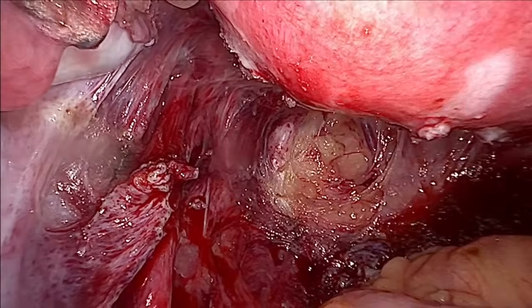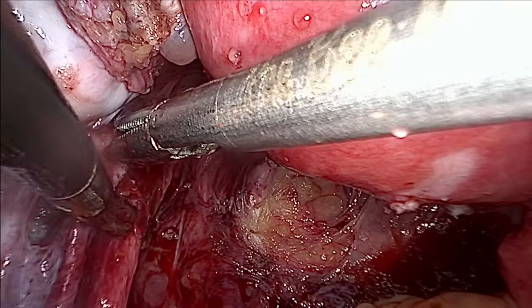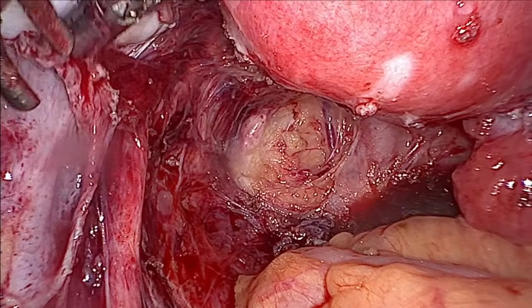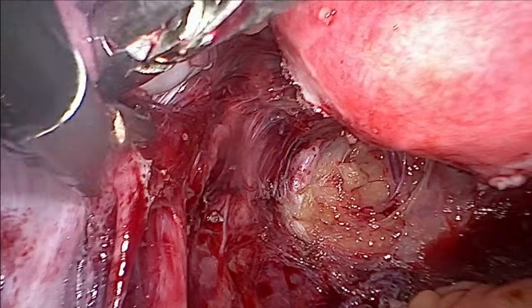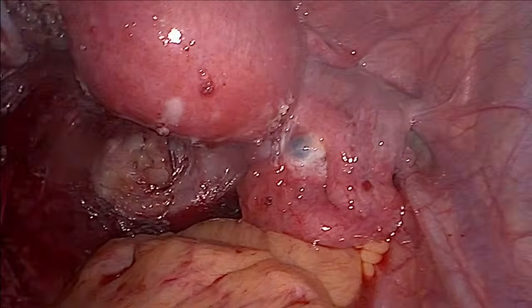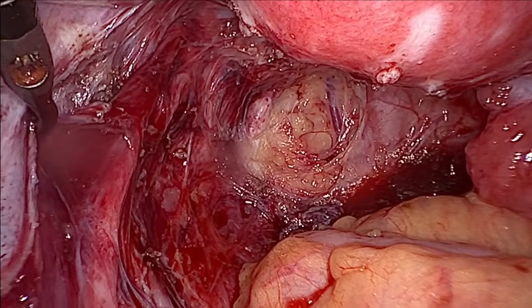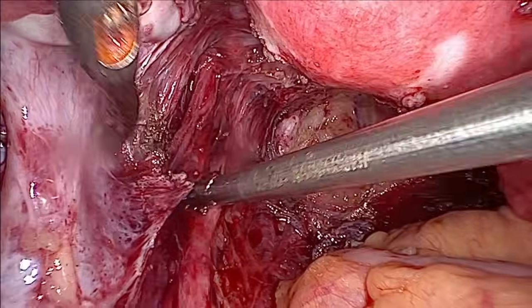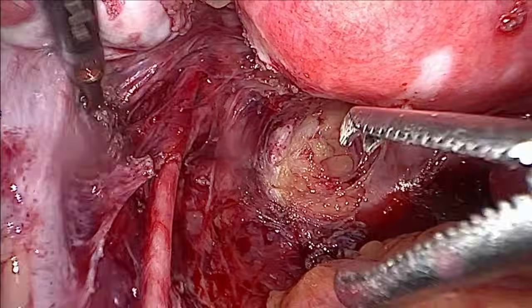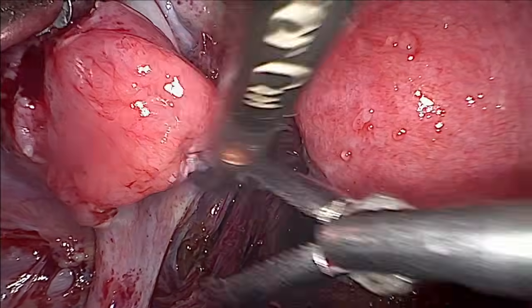Okay. This is the normal peritoneum here. Okay, you can see the vesicular endometriosis here.